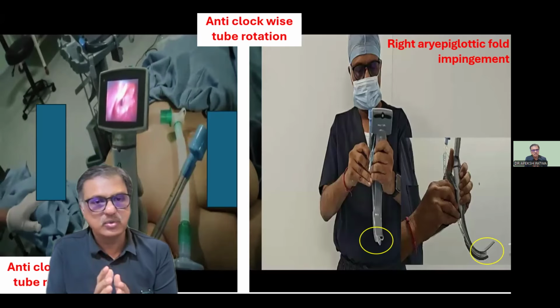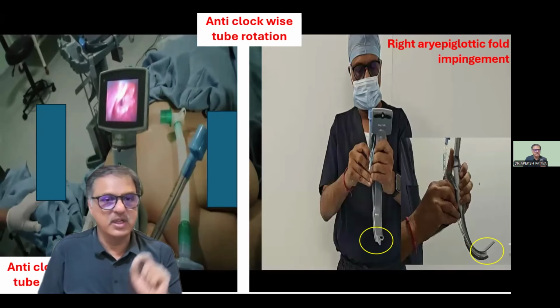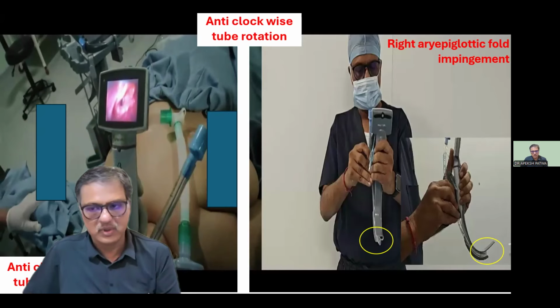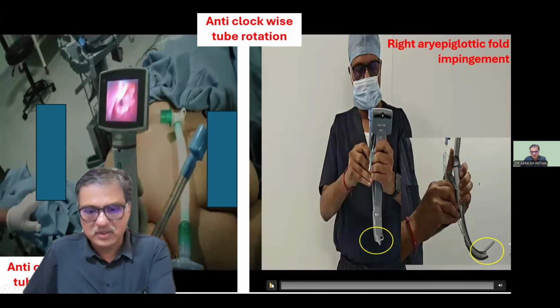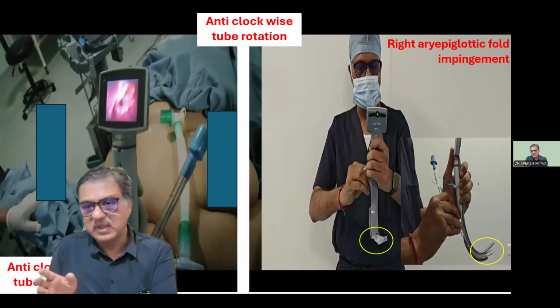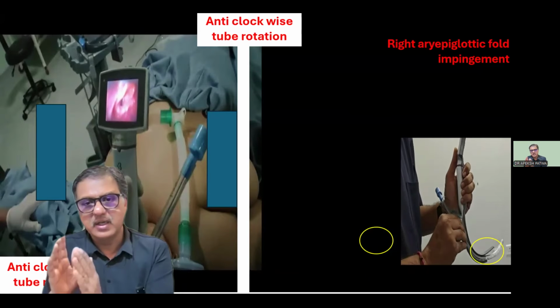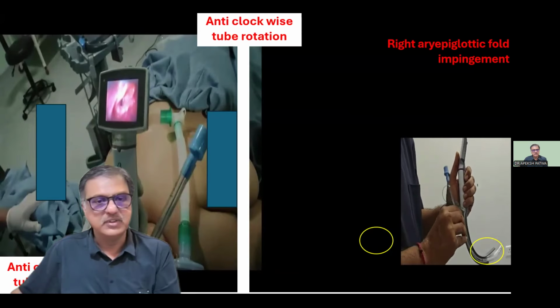And you have to do exactly the opposite maneuver if your tube is getting impinged at the left aryepiglottic fold. I'm showing another video for this maneuver, the anti-clockwise rotation of the tube inside the channel for right aryepiglottic fold impingement.